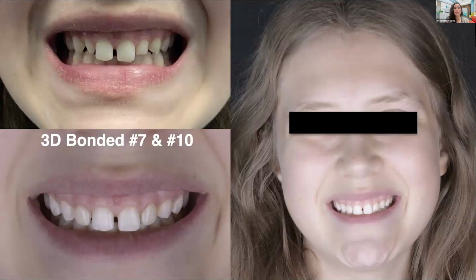So when we're taking records to talk about anything cosmetic, or most things in our office, we take full digital scans, upper, lower. We're doing a full photo series. My hygienists do that as well. So every new patient in our practice has that. Most patients that are coming in with any type of concern that's aesthetic or ortho or anything like that, the assistant is already doing all that before I even walk in the room. And so that's something I can delegate to the assistant: hey, ortho's asked for us to mock up 7 and 10.